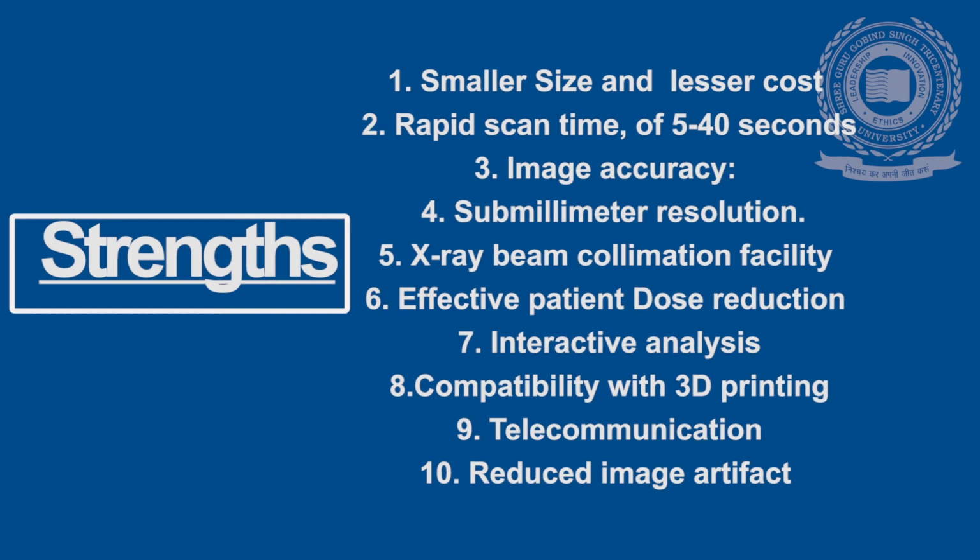The data is in DICOM format, which enables ease of telecommunication, and reduced image artifact due to availability of artifact suppression algorithms, which have led to a low level of metal artifacts.